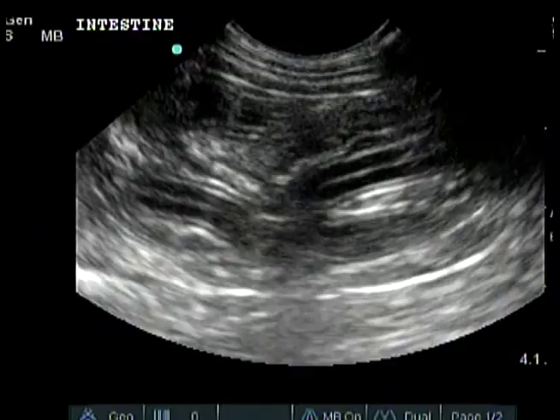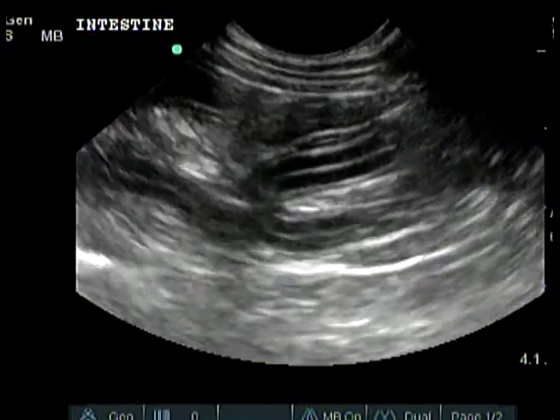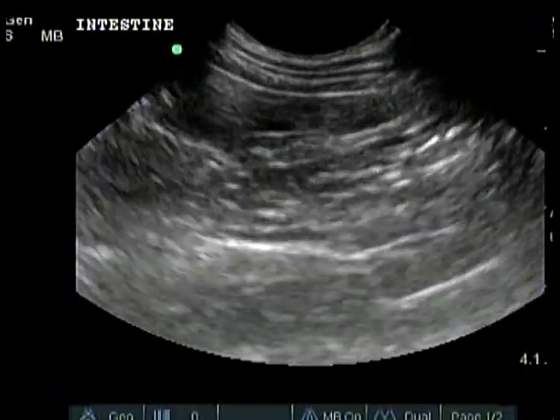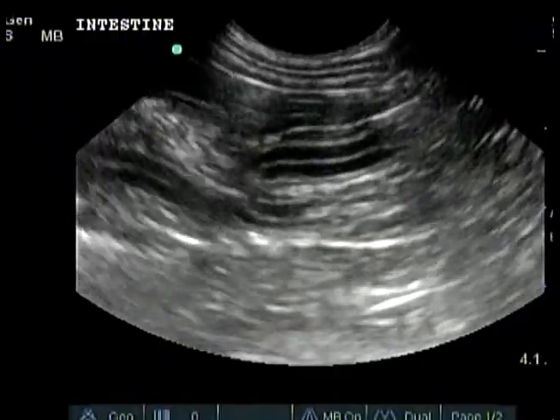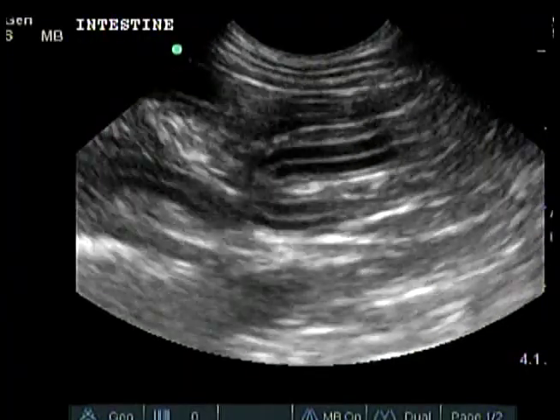The normal intestine may contract 1 to 3 times per minute. Intestines contract less frequently than the normal stomach and are not usually very active. It is uncommon to see an intestinal contraction while making the zigzag pattern to scan the intestines. If you note contractions while making the zigzag pattern, stop and further examine the area.